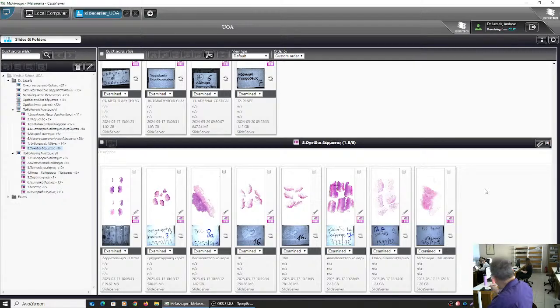Because if I start in each slide and say, this is the dermis, this is the epidermis, this is the mitosis, this is the necrosis, then we'll just have an exam on skin neoplasms, not on other parts. So I'd better hurry now.